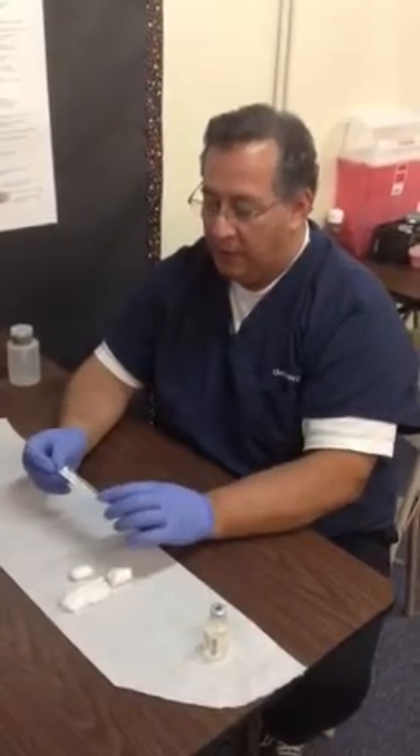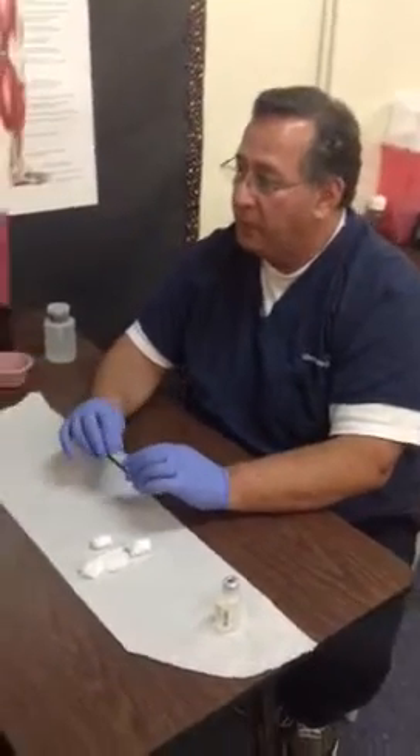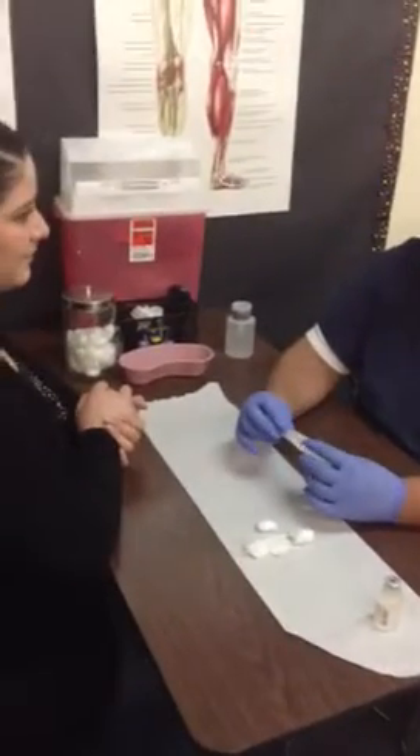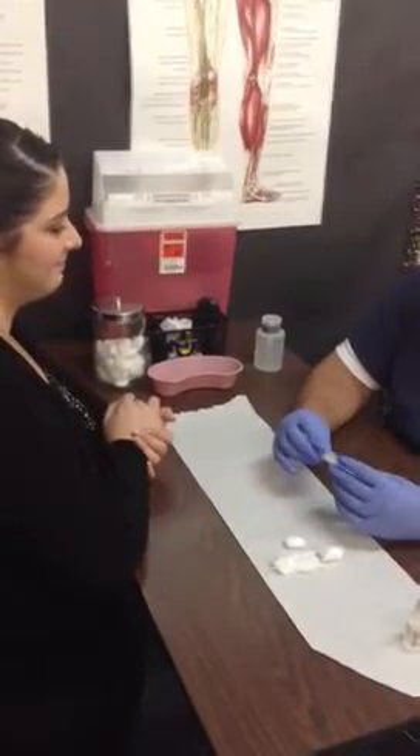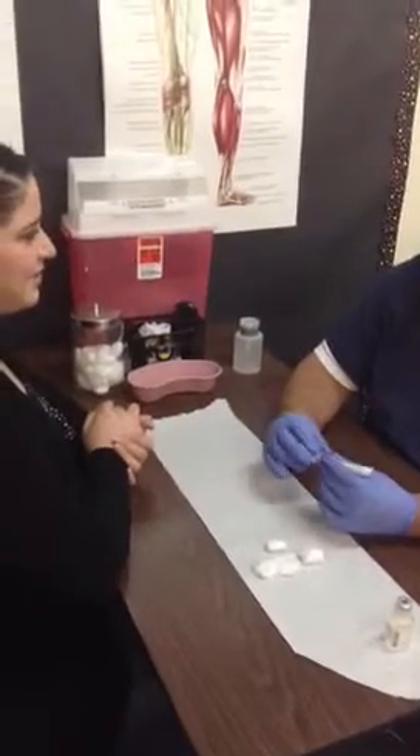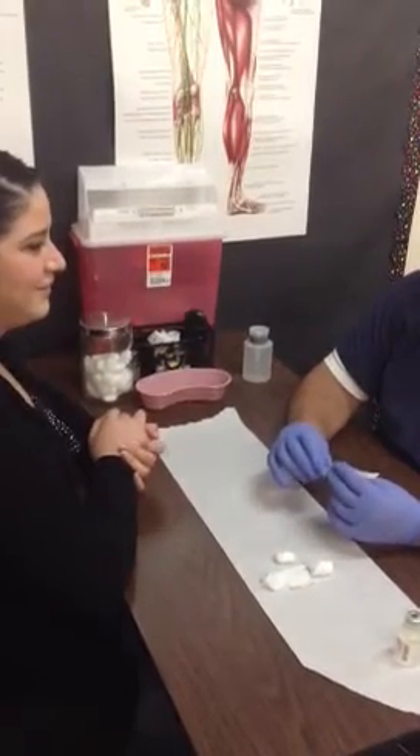The first thing I want you to do is to always remember to identify your patient. Hi, my name is Carlos. I'll be giving you an injection in your muscle, your shoulder muscle. Is that okay? And can you state your first and last name for me, please? My name is Jane Doe and my date of birth is 8-12-92.